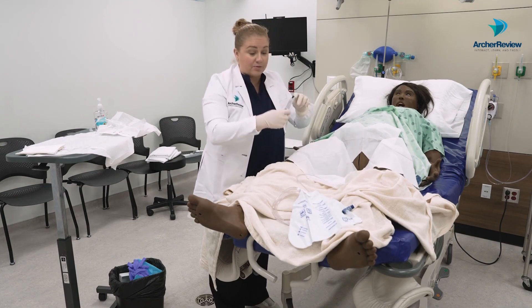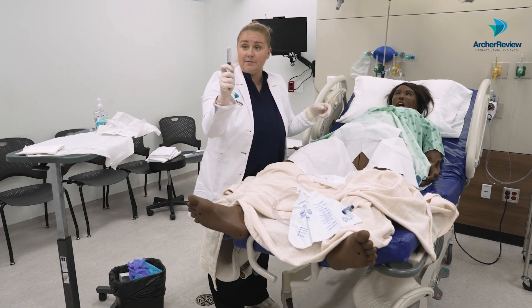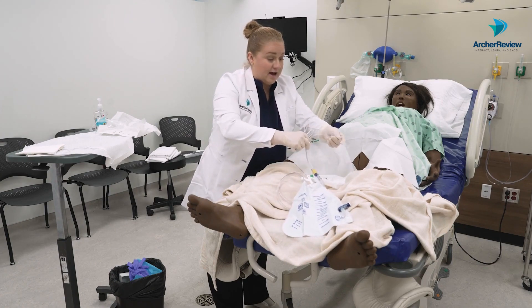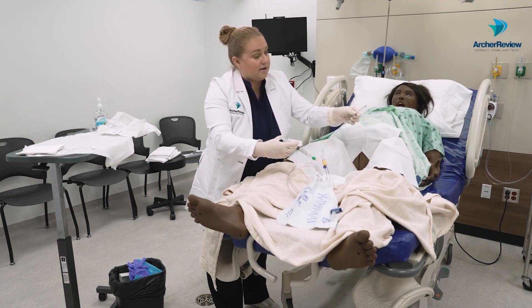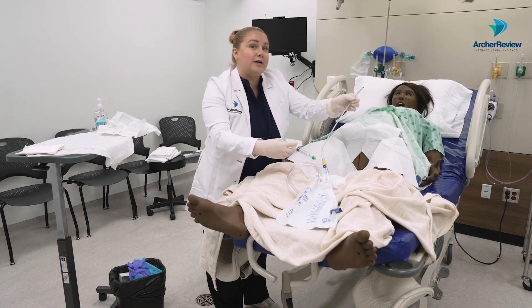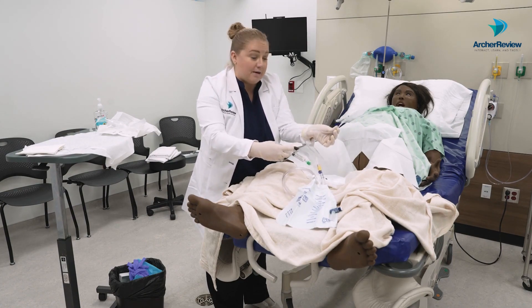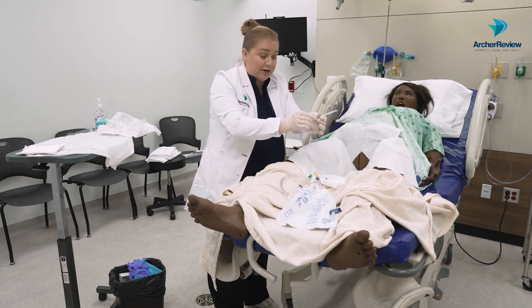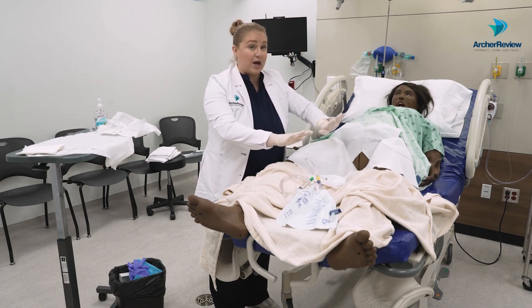I can then take my pre-filled syringe — this just has some saline in it — and very carefully attach it to the balloon port. See how that inflates? That's what's going to keep the catheter in the bladder once it's all the way in there so that it doesn't slip back out. I'll deflate it and leave the syringe attached so that it's ready, then place the catheter back in the lubricating jelly, being very careful it doesn't touch anything.